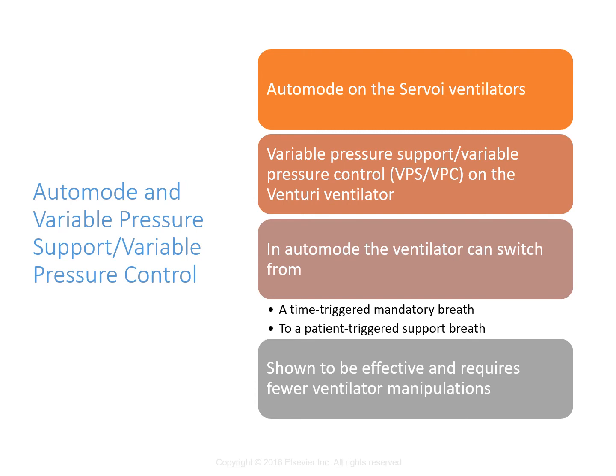So auto mode can be set to switch from pressure controlled CMV to pressure support if they're more comfortable with that pressure support method of weaning. So that's something that you could consider with the care team as well. And it's been shown to be pretty effective on patients. And it really requires fewer vent manipulators and techniques. And like I said, it's automatic. It does it. You could come into the room and see that they've been weaning for 20 minutes already.